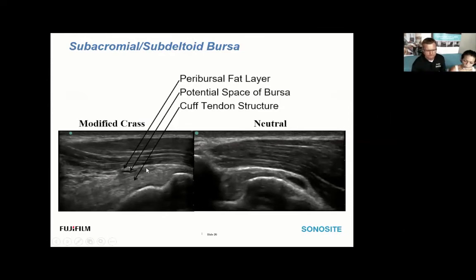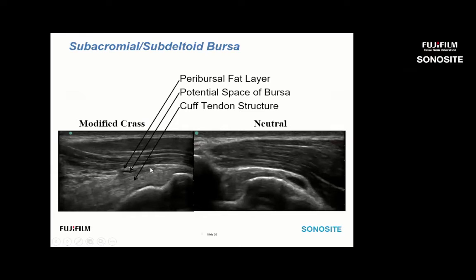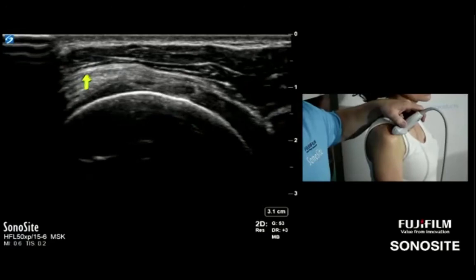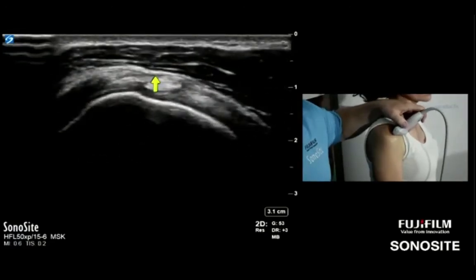A couple other structures to address quickly: the subacromial subdeltoid bursa comes out from under the acromion. With the arm slightly abducted and looking for subacromial impingement, as tissues slide beneath the acromion, you'll often see a little teardrop of fluid accumulate in the distal subdeltoid bursa. The bursa is lined by peribursal fat. If there's any fluid in this potential space, you'll see a little distention — also useful when guiding a needle. The subacromial subdeltoid interface is this thin, almost imperceptible line with layers of peribursal fat and peritenon around it.